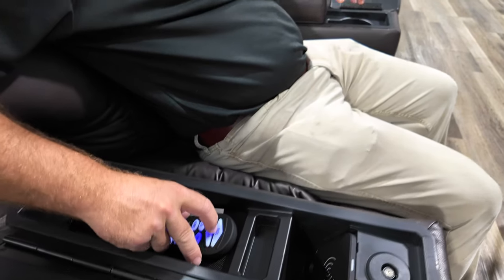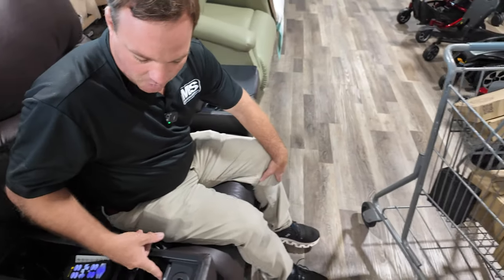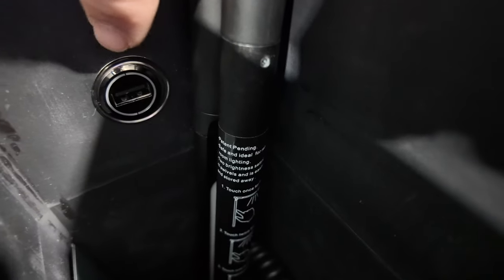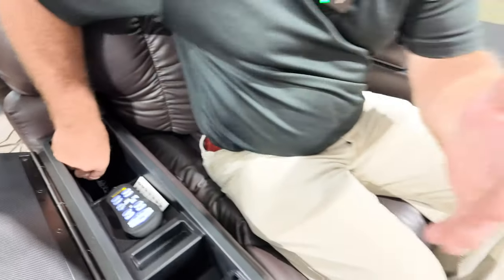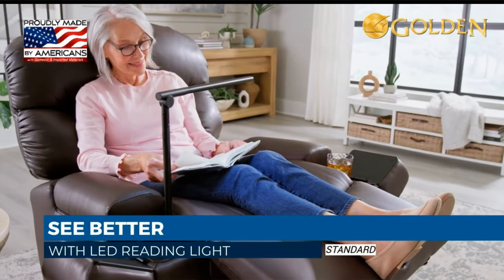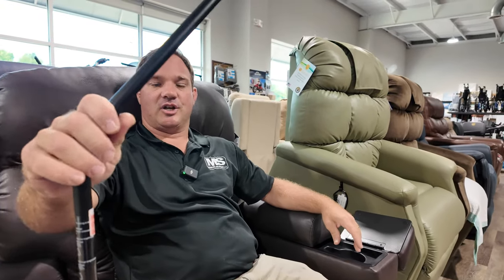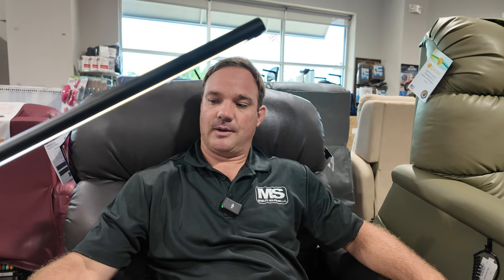Right here is your head and lumbar controls — power headrest and power lumbar. You can also control it from here. If you don't have a smartphone for wireless charging, there is a USB charging port. What comes stock with this chair in terms of accessories includes this light. It comes with the chair and is a power station — adjustable up and down — with two brightness settings: dim and bright.